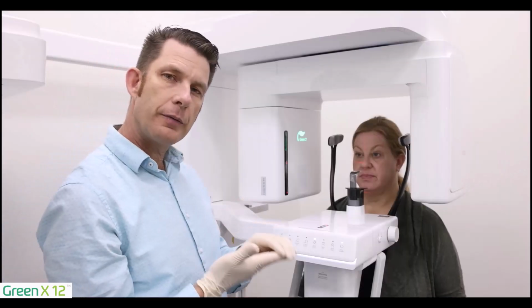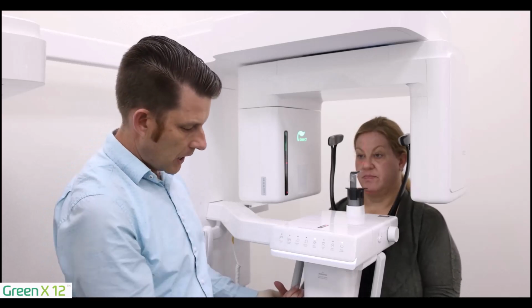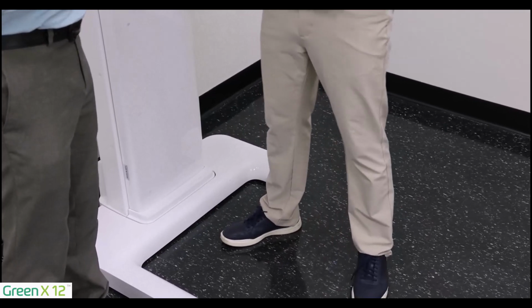A couple things to start with for patient positioning. I'm going to start with the hands. Go ahead and hands palm facing up. Go ahead and walk forward, feet shoulder length apart. And then I'm going to have the patient bite on the bite stick.